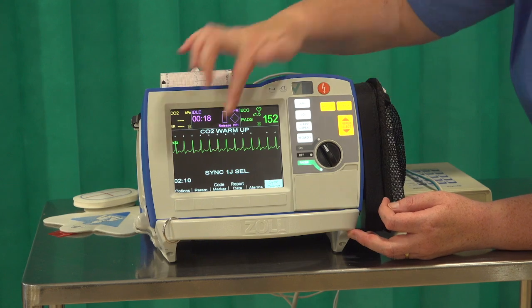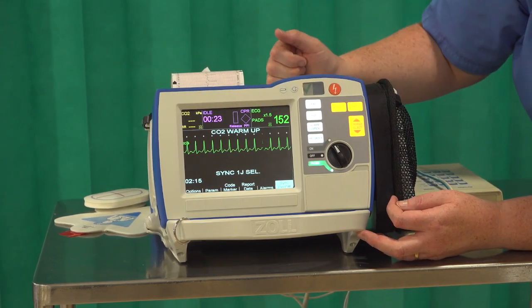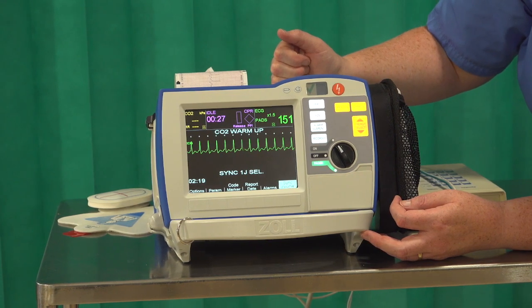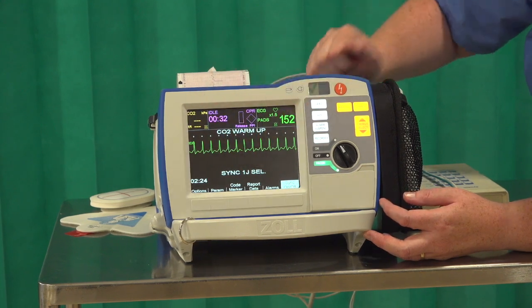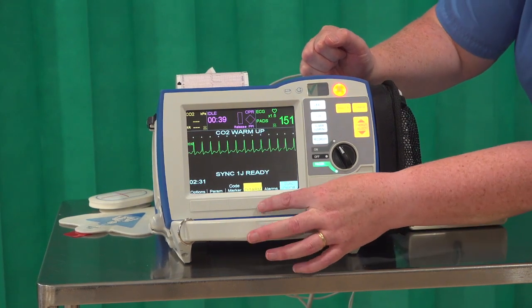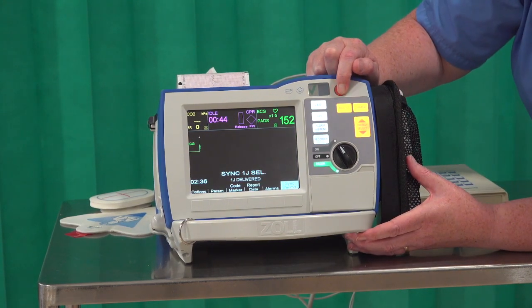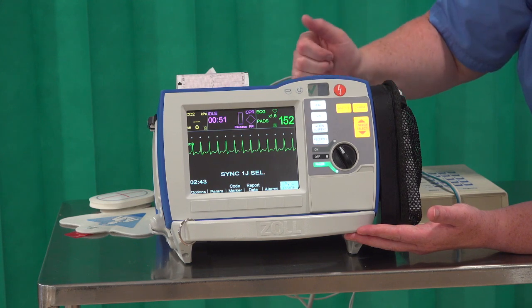You'll see a couple of things: it'll say sync on screen, and you'll see little arrows marking your R-wave, because that's when we want to make sure the heart receives electricity. Then you use it as you would manually — select your energy, say one joule. Then you charge. If you press in error, the disarm button is the soft key. When fully charged, hold your shock button a fraction longer than you normally would, because the machine is waiting to sense when to deliver the shock.